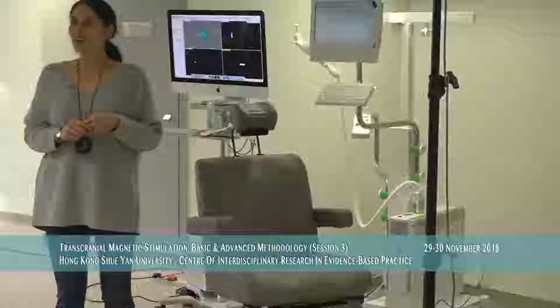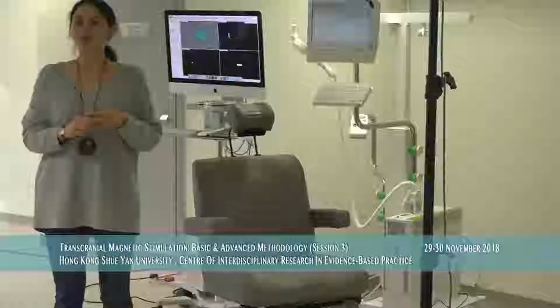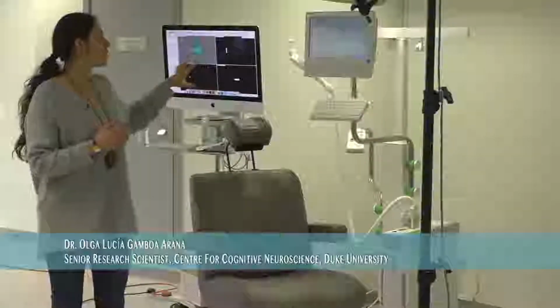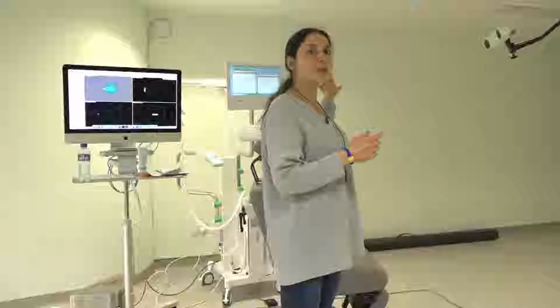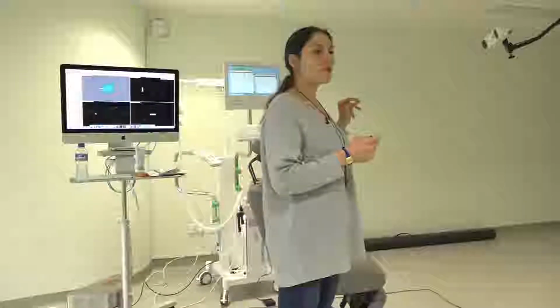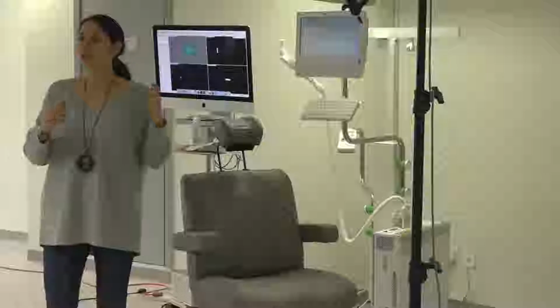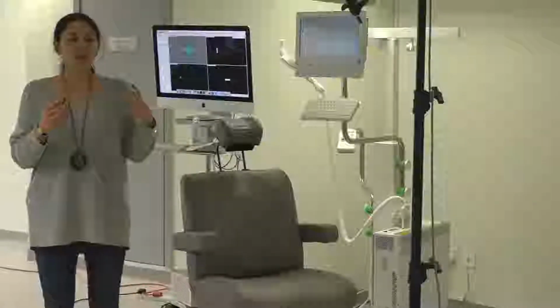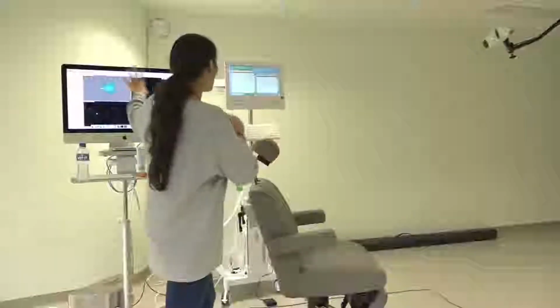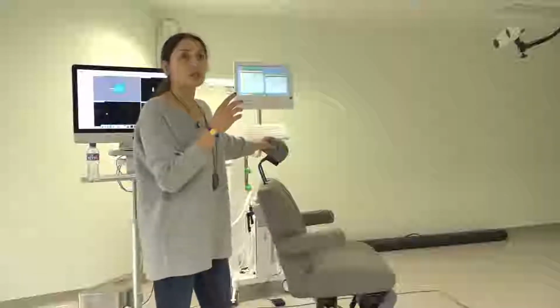I don't know how to start this because the whole procedure is a little bit complex. You have our equipment here, very modern equipment. I'm actually not sure how to start. Well, the first thing is that you have these two machines. Probably you will work with these two machines.